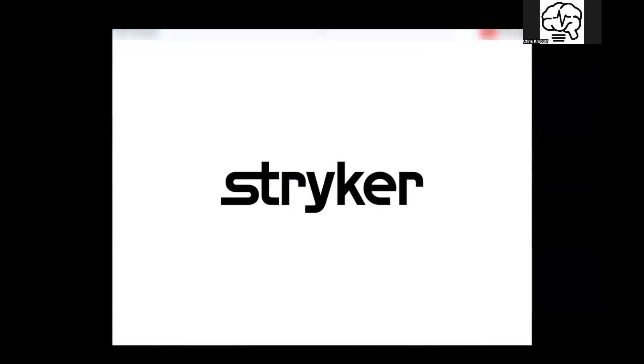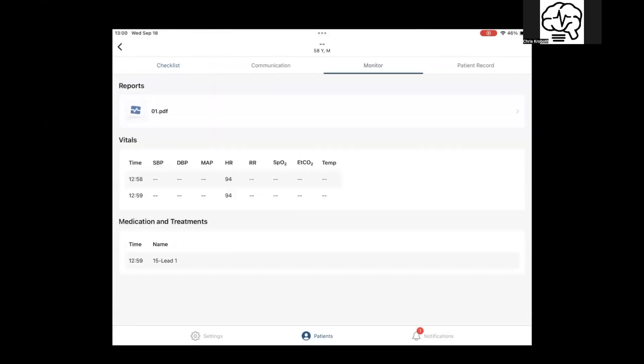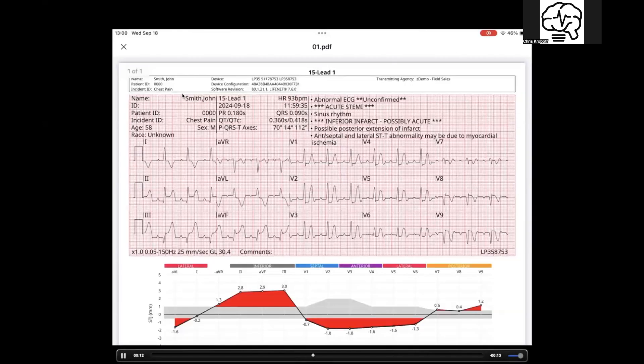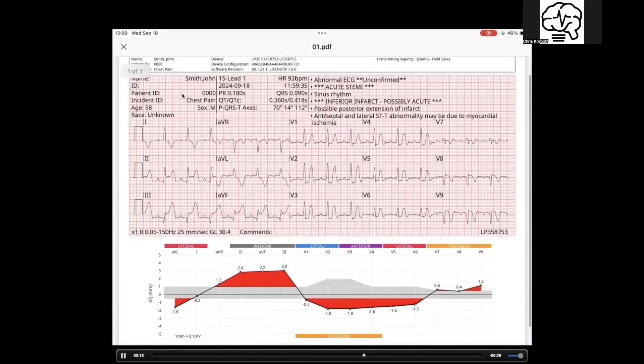So this is if the tablet was locked — you get a message saying hey, you got a transmit. It's real quick. Come over, find the patient, go to monitor, pick the PDF image right there, and it brings it up. Look how high-res this is, and look how fast that was. That was a local transmit — you're in the unit, on the scene adjacent to your device. That is very quick.